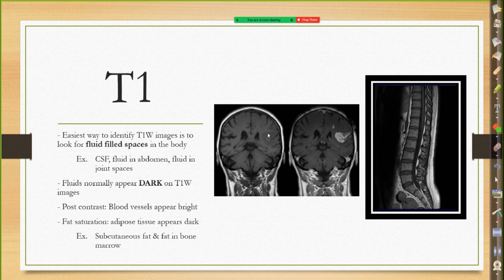Because look right here. This is what it looks like pre-contrast, and this is now contrast. And that's why contrast is so great, because it's hard to see that pathology without the contrast enhancement, and then now we can see it more definitively. And we can see the edges of whatever pathology that is, probably a tumor.